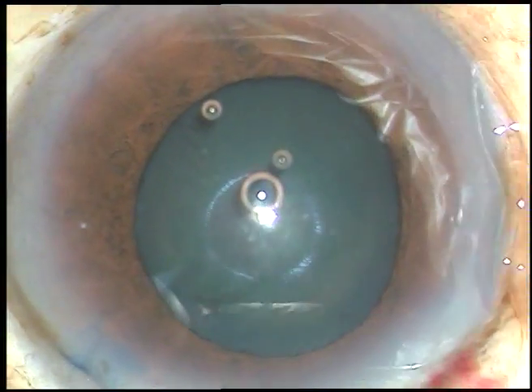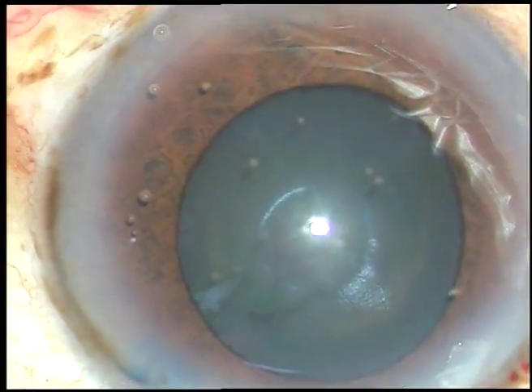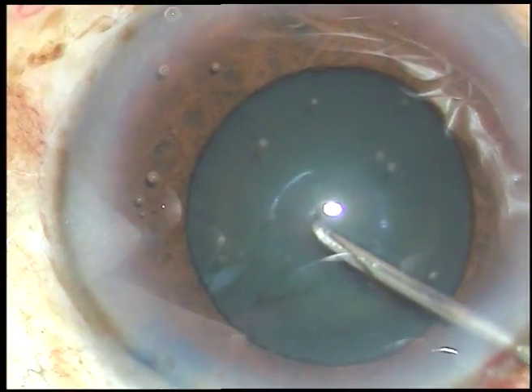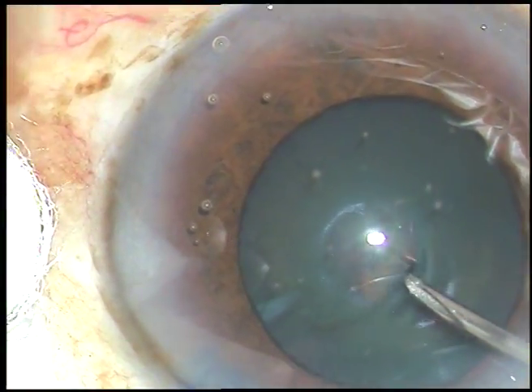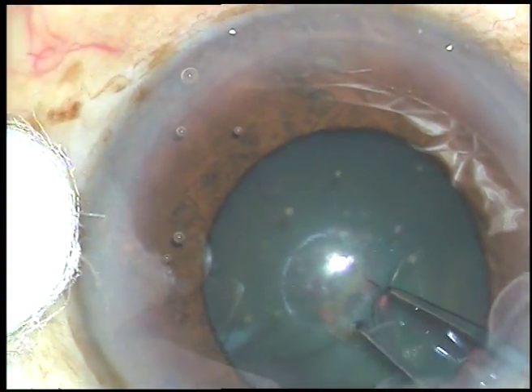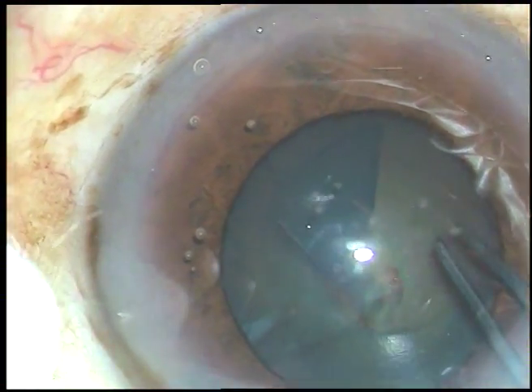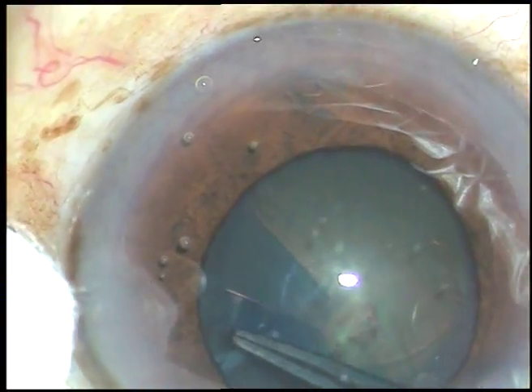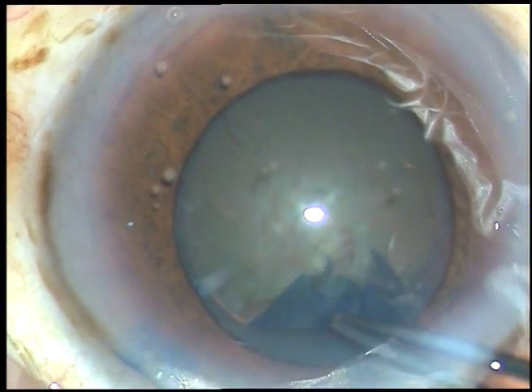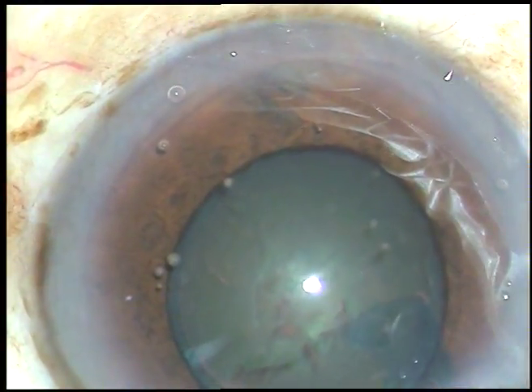Now viscoelastic substance is injected into the anterior chamber, and now I am going to do capsulorhexis. The anterior capsule is incised with a 26-gauge needle. Now utrata forceps is taken. The flap is grasped with the utrata forceps. I go anti-clockwise and complete the CCC.